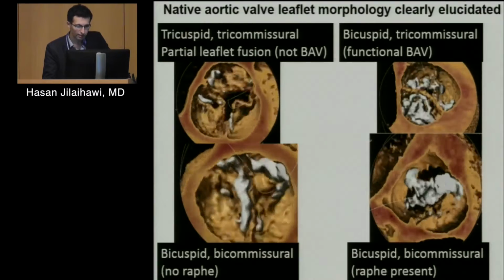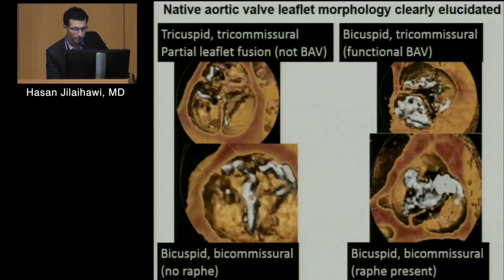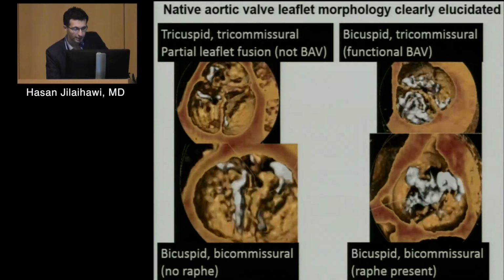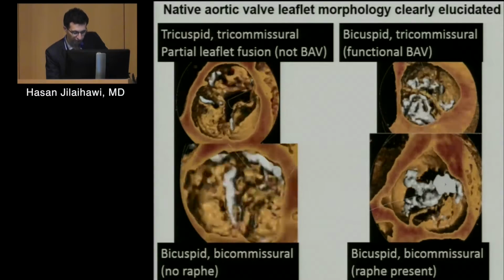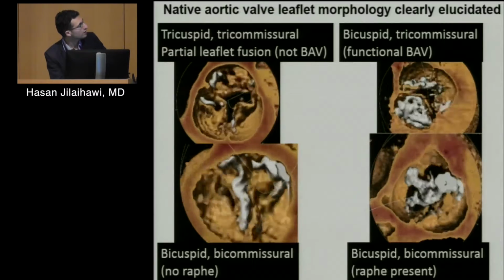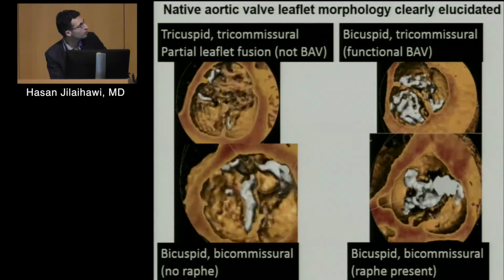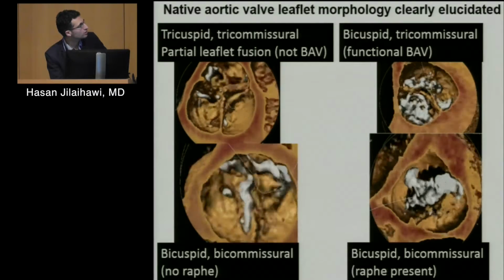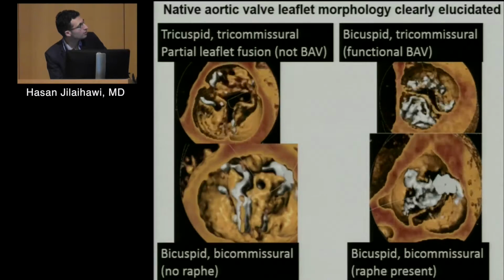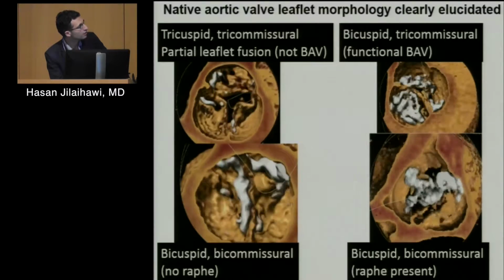And then we turn to valve function. We can see very, very clear images with superior spatial resolution. And we can delineate very clearly calcification. You see here on the top left image, you see partial fusion causing aortic stenosis. You see limited calcium that can help us decide which valve we choose. We may prefer a self-expanding valve in such a case.